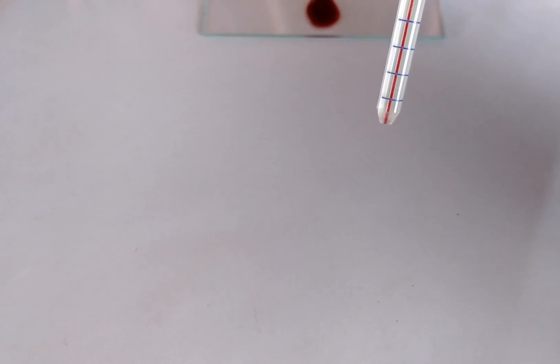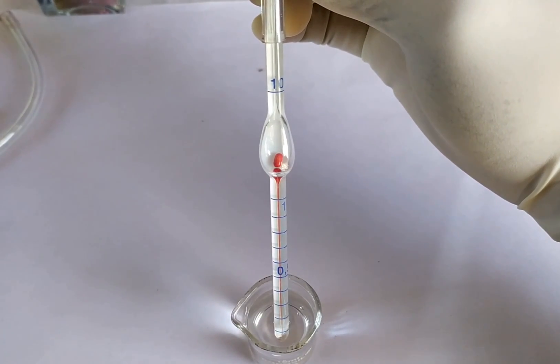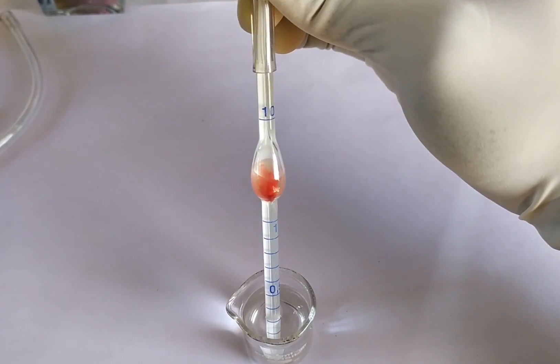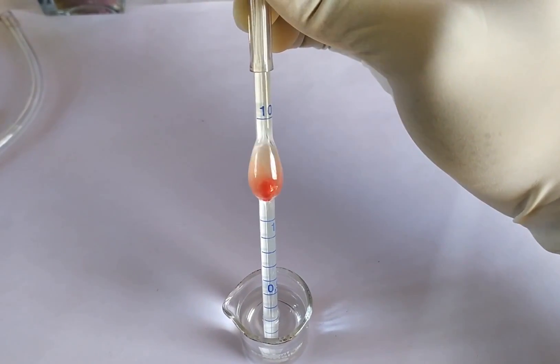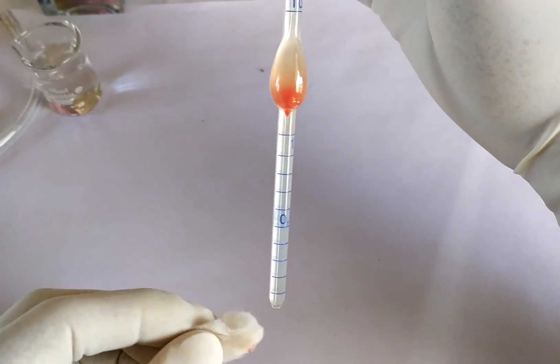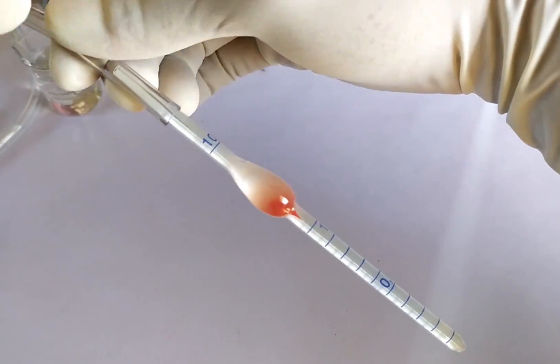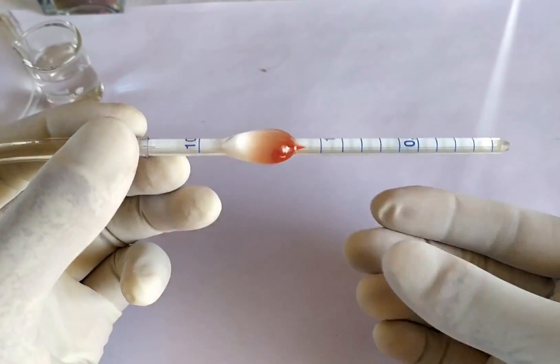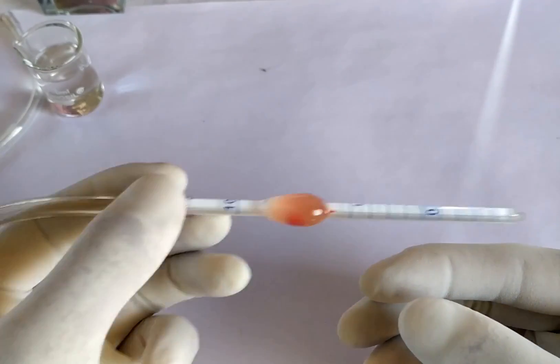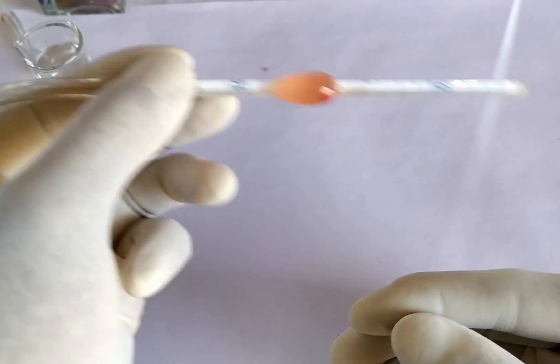Now carefully draw the RBC diluting solution up to the 101 mark on the pipette. Hold the pipette in a horizontal position and rotate it several times so that the tiny bead inside the bulb of the pipette mixes the blood and the diluting solutions thoroughly. Once thorough mixing has been accomplished, the blood sample now has a 200 times dilution.